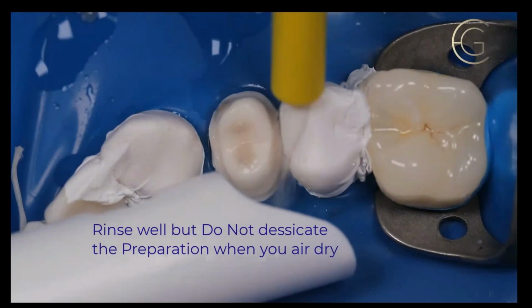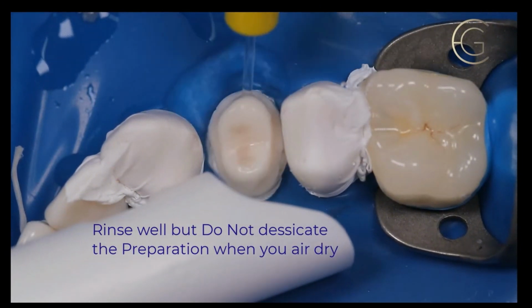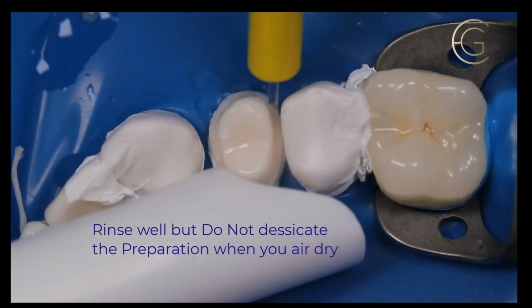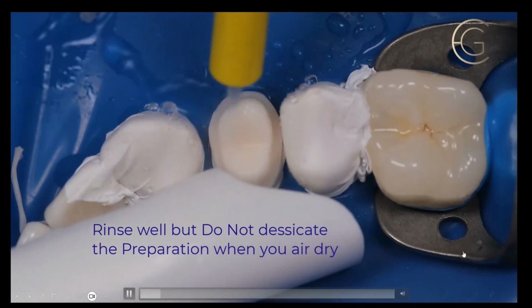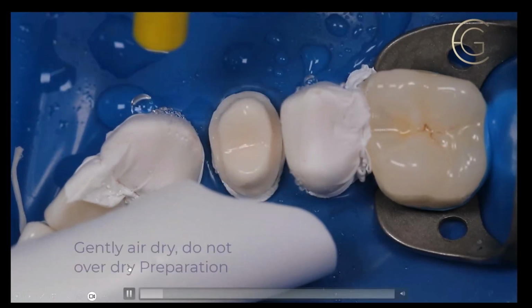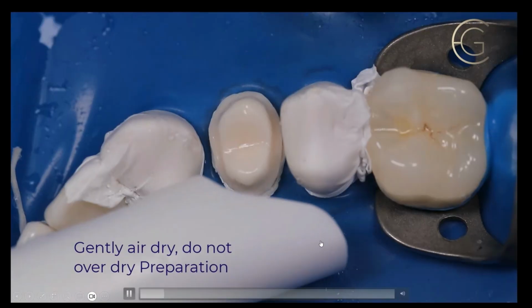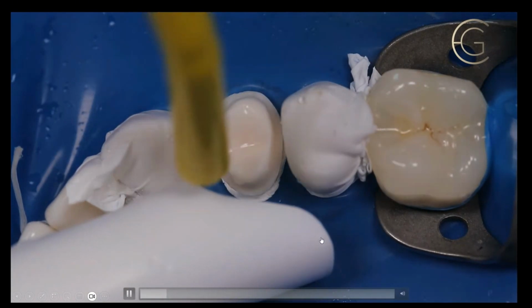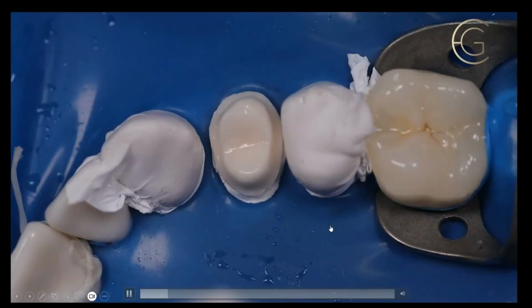But you don't want to desiccate. Now, keep in mind, this tooth has IDS and resin coating, okay? So if you have a tooth that doesn't and you over air dry it, you're going to have a lot of sensitivity. Okay, so I like to leave it slightly damp. Okay, everybody with me? And now we're not going to over dry the prep, and we're really good. So I've got that Teflon packed on the adjacent really well.